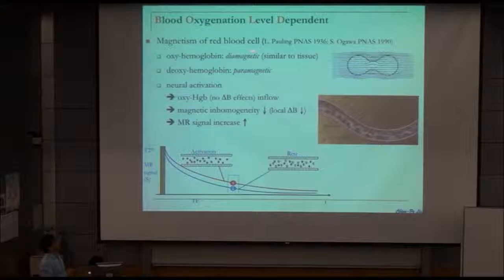So actually there are different magnetic properties in this environment. As we just introduced, outside of the vascular system, that means the cerebral gray matter regions, we can see in this region and this region they are full of oxygen.